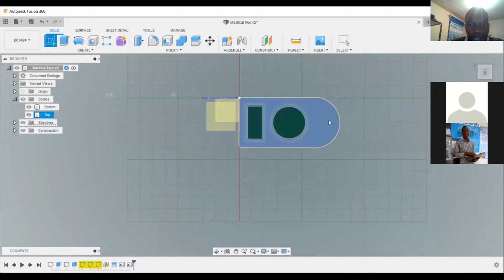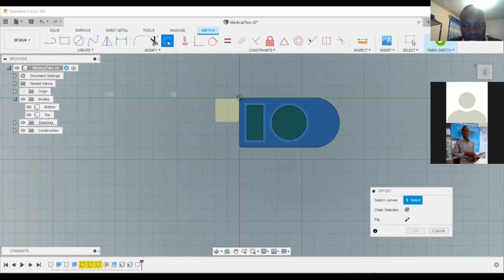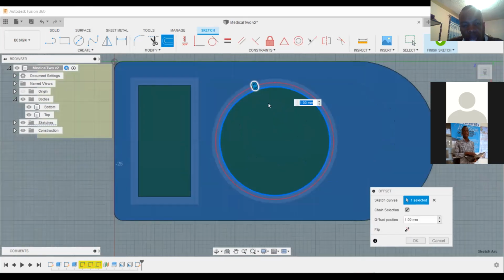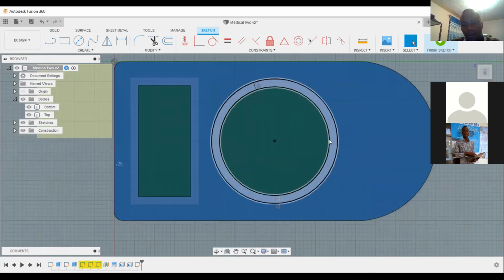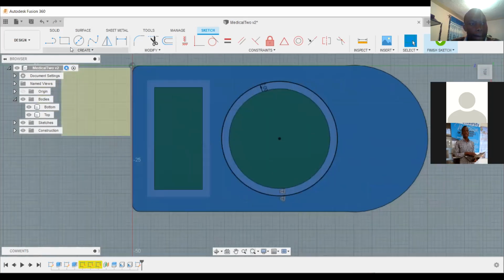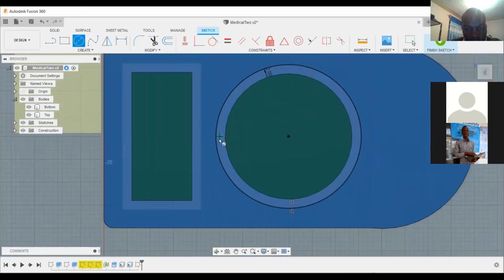How do we do it? You come and create a new sketch on this surface. You could do that, or you could click offset. Then you have set this by like 1 millimeter or even 2. So that iko hivyo. Then we want to draw the circles which were in between here. You can draw it whichever side you want.